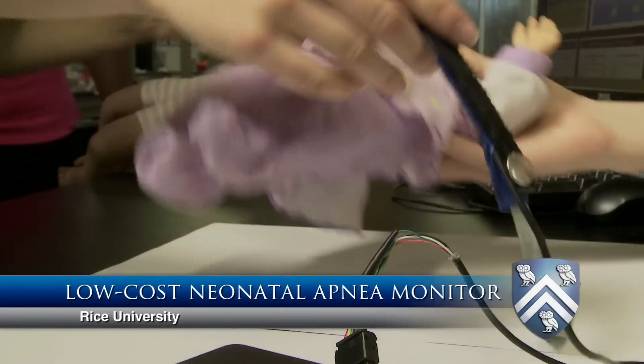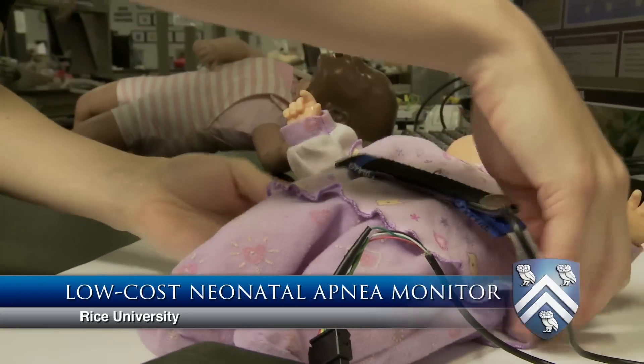We're team Breath Alert and our goal is to design an apnea monitor for premature infants in the developing world.